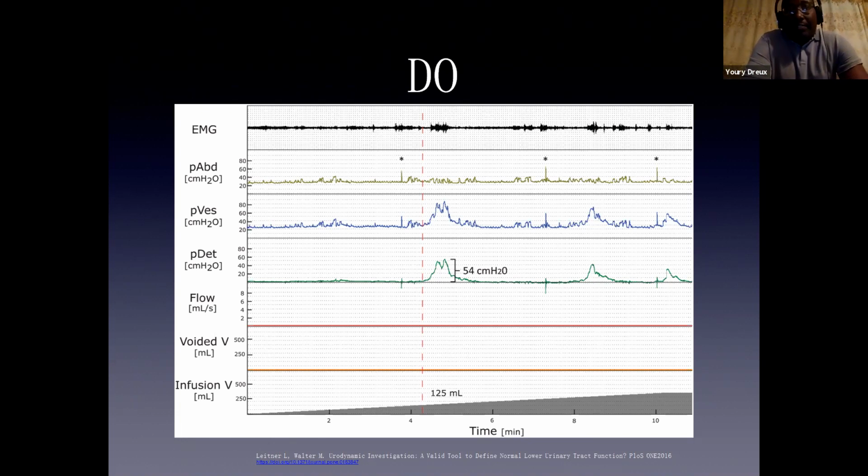But we couldn't have this thing prior to the surgery to predict what he's going to have after the surgery, if he's going to pee or something else. Yeah, I think there's some information that you can get without fancy machines like this, including, obviously, you can measure how much the person went, and you can measure their residual either by cathing them or if you have a bladder scanner. One of my old partners who is now retired, he'd say, stand there and watch them go, right?